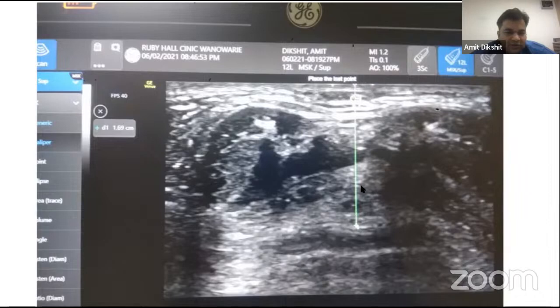Till date, most of the studies have used this black hypoechoic thing as the epiglottis, and they have measured the skin to epiglottis distance from its top to the skin. Whenever the value is more than 1.9, we have used it in our study as well, and it fairly correlates with our patients. One of the important facts is we do not have normalcy data for the Indian subpopulation. As far as I know, Apeksh sir may be telling us more about it, but as ultrasound in this area is emerging, we sometimes have to depend on Western population data.